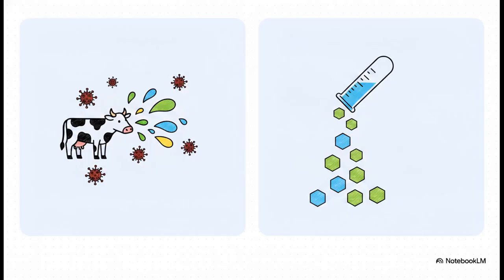So, the modern biotech industry is actually heavily shifting away from riskier animal-derived media and moving straight toward chemically defined systems. Historically, we had to rely on animal-derived components to get cells to grow. But the thing is, animal products are naturally variable. Literally no two batches are exactly alike, and they carry this really scary theoretical risk of introducing adventitious agents like viruses. By switching to chemically defined serum-free systems, we know exactly what is going into that culture, right down to the molecule. It drastically improves batch-to-batch consistency and overall safety.